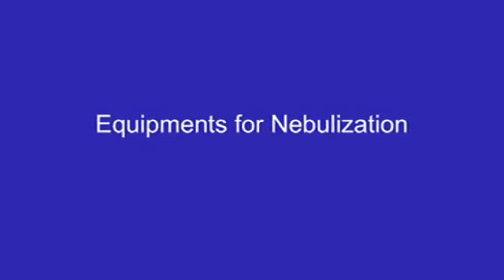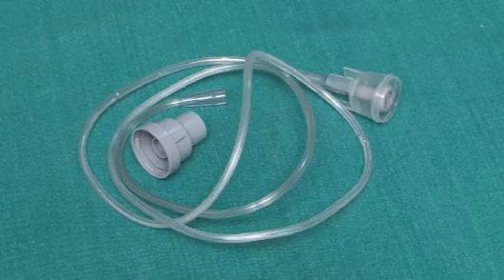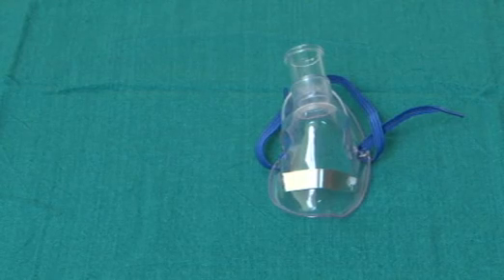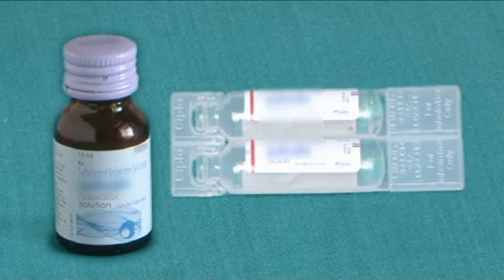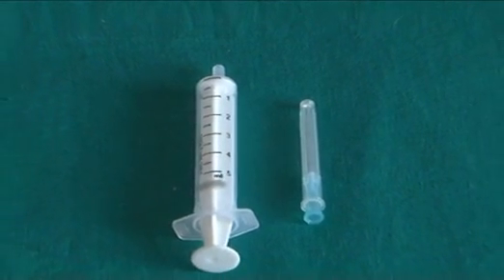Equipments for nebulization: nebulizer, connecting disposable tubes, mouthpiece for older children, face mask for infant, normal saline solution, drugs to be given through the nebulizer, 5 cc syringe.